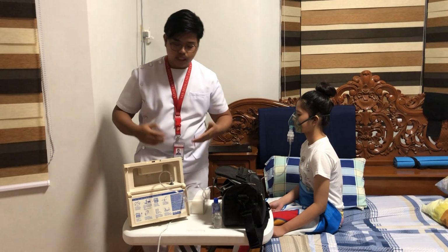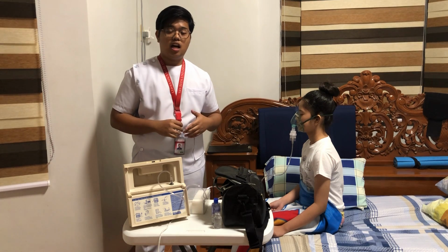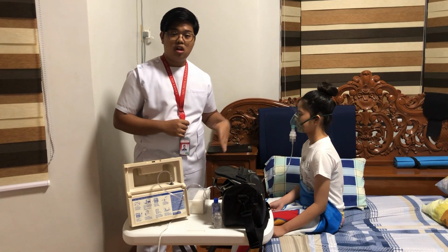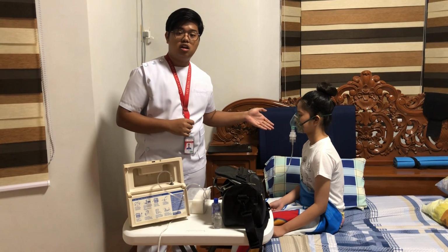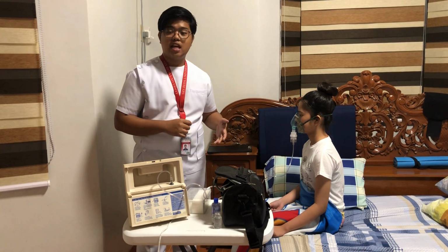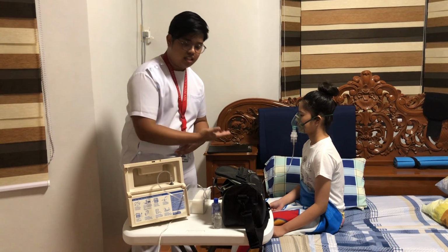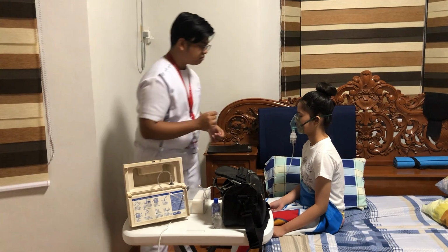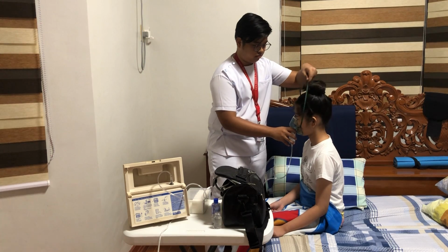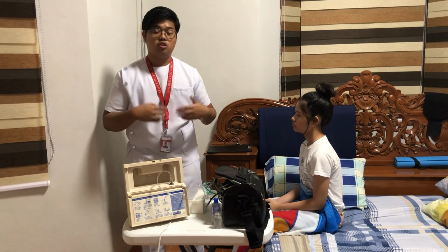And then again, we will now begin the nebulization. And then throughout the process, we need to remain with our patient during the treatment until all of the medication in the nebulizer has been aerosolized. So the whole process takes up to 15 to 20 minutes, and let's say that it is already done.